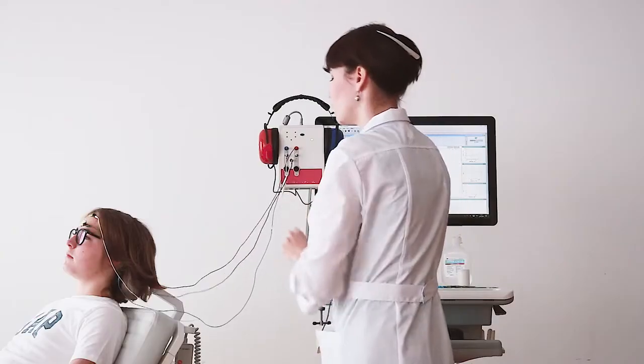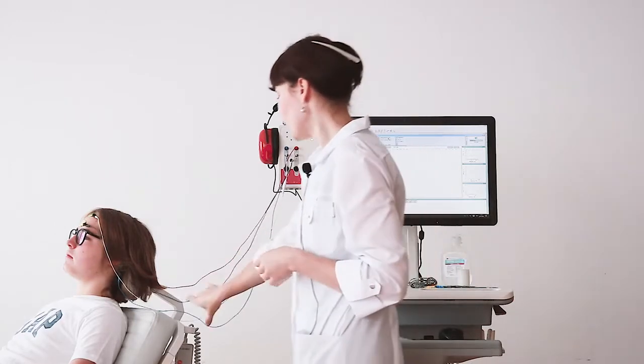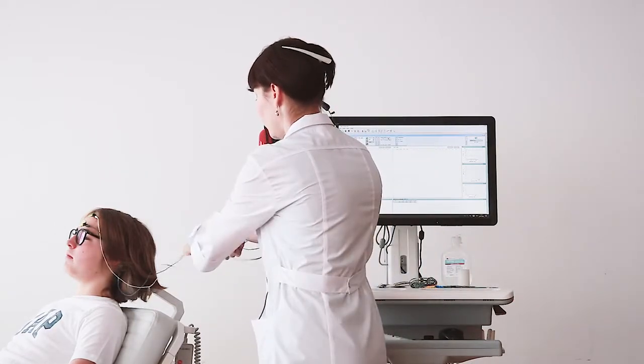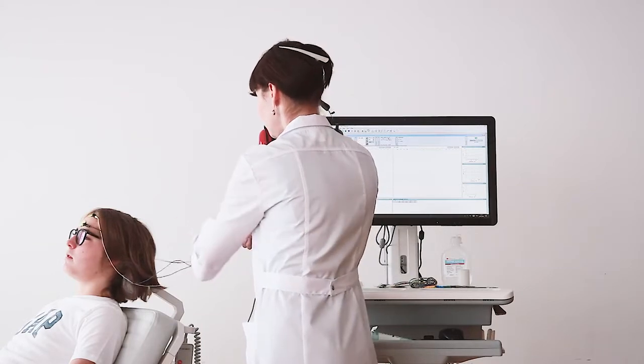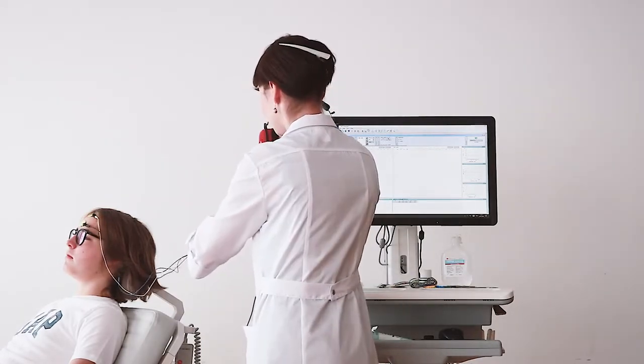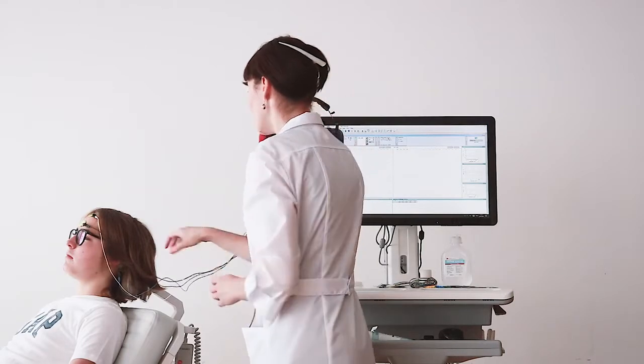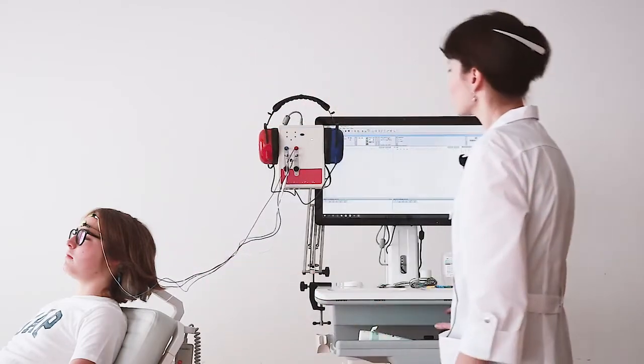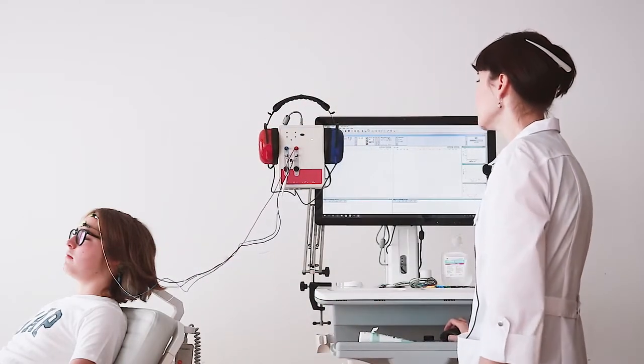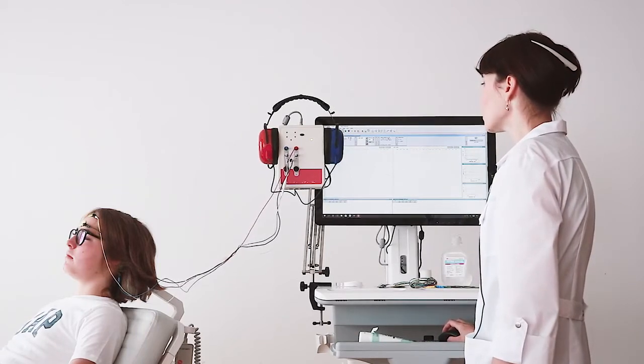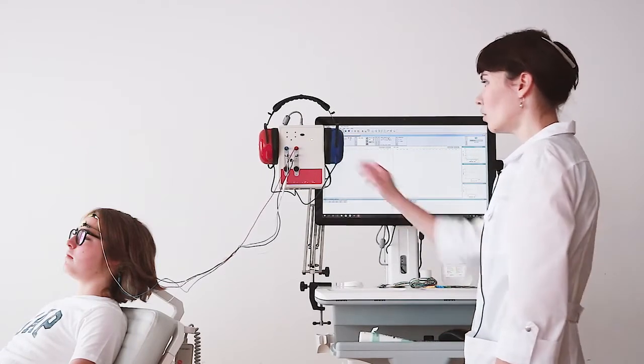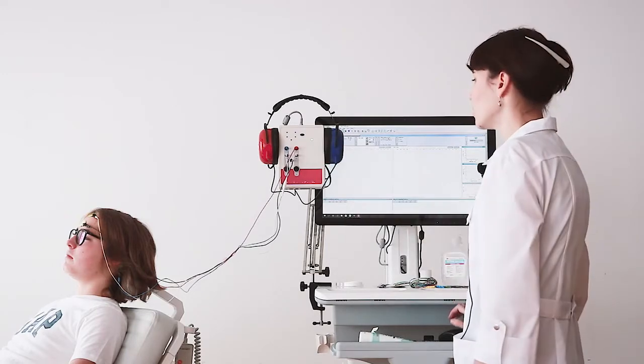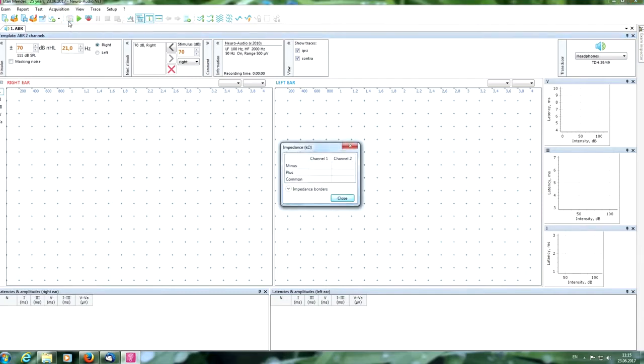To prevent much noise, we need to collect our cables together. After positioning the electrodes, we need to check the quality of it by pushing the button of impedance here in the program or on the main front panel of our amplifier. As we can see, our impedance is good enough.